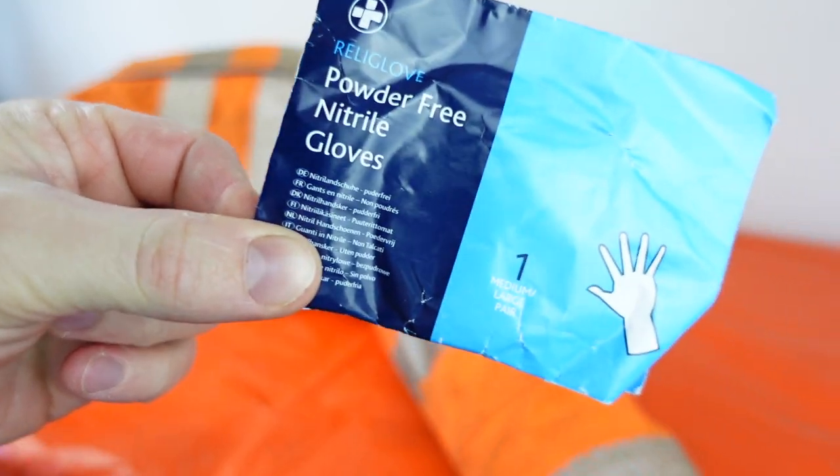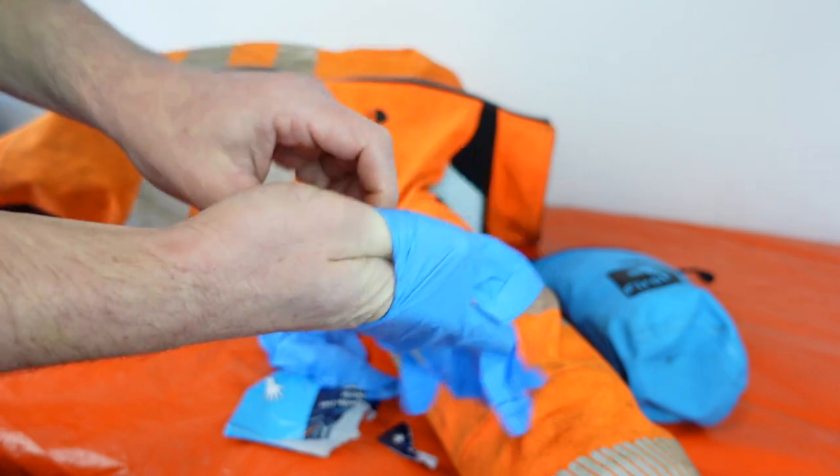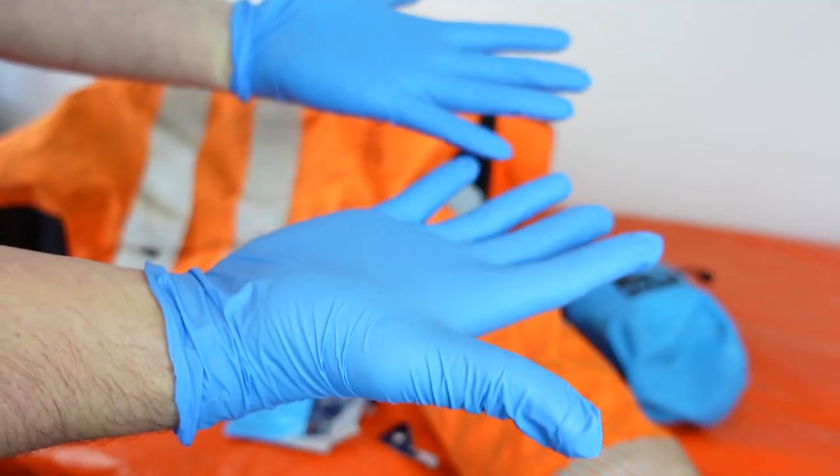The first thing out of the pack is a pair of powder-free nitrile gloves. These are vital to reduce the spread of germs and bacteria, minimising the risk of infections.